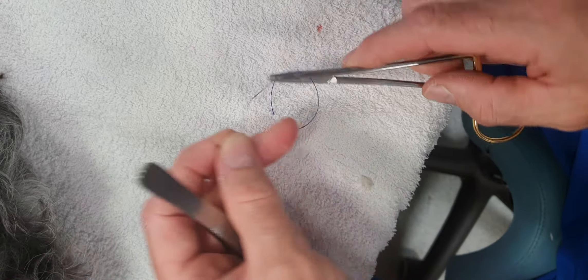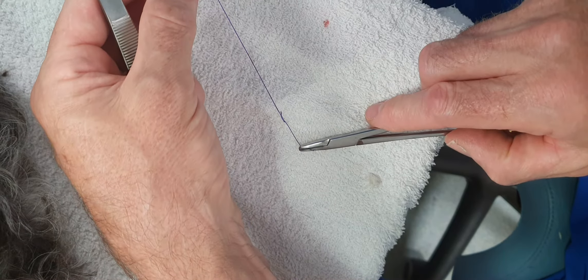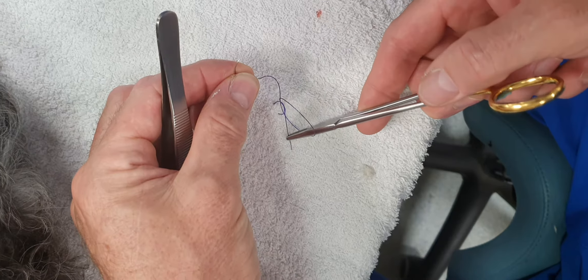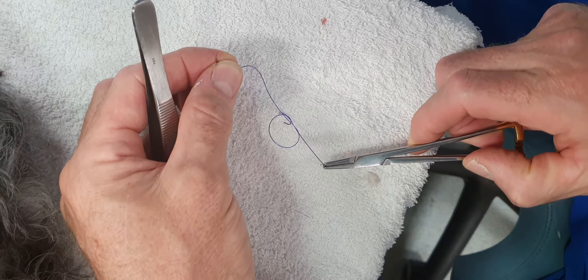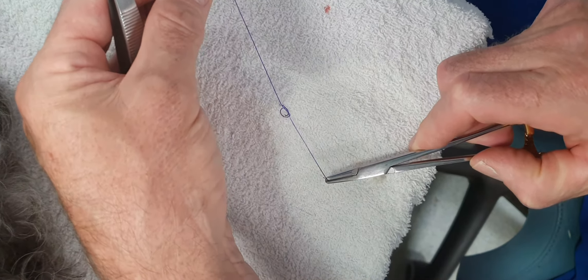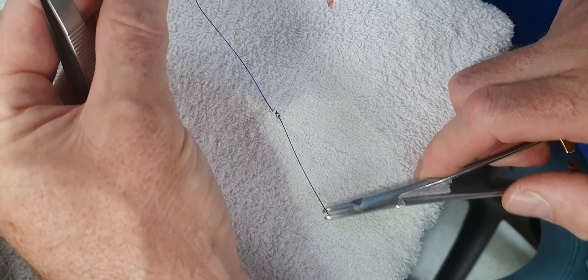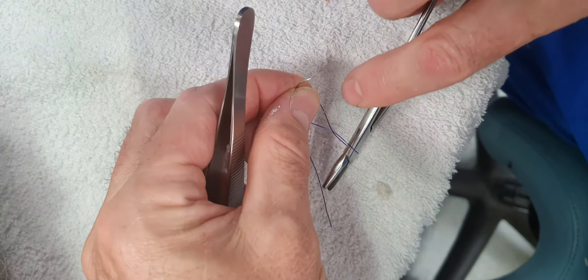The second throw is kept on the same side as the suture enters the first throw, which allows that knot to slip and give precise control of your tension. Square knots are then placed on top.